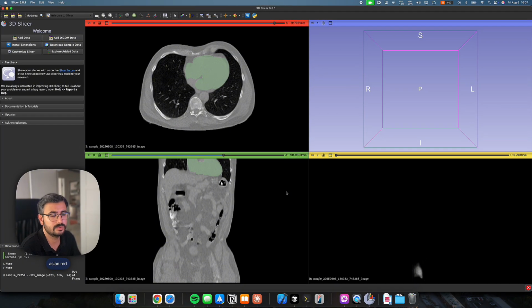Yeah, that's all for today. We created synthetic CT scans using NVIDIA MAISI and our own GPU. I showed how you can use it online and how you can use it on your own GPU workstation today.